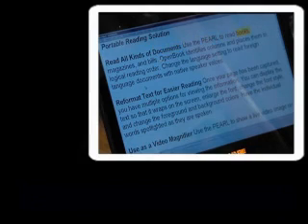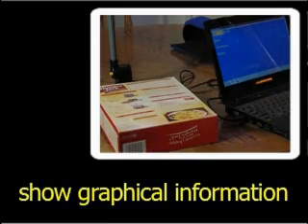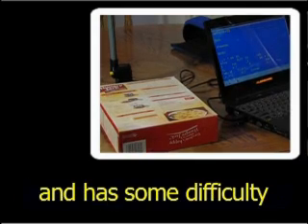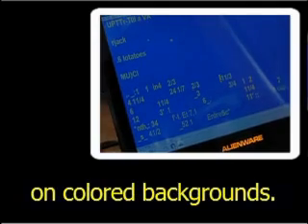Separate words are highlighted as the user operates this model. This display mode cannot show graphical information and has some difficulty displaying text on colored backgrounds.